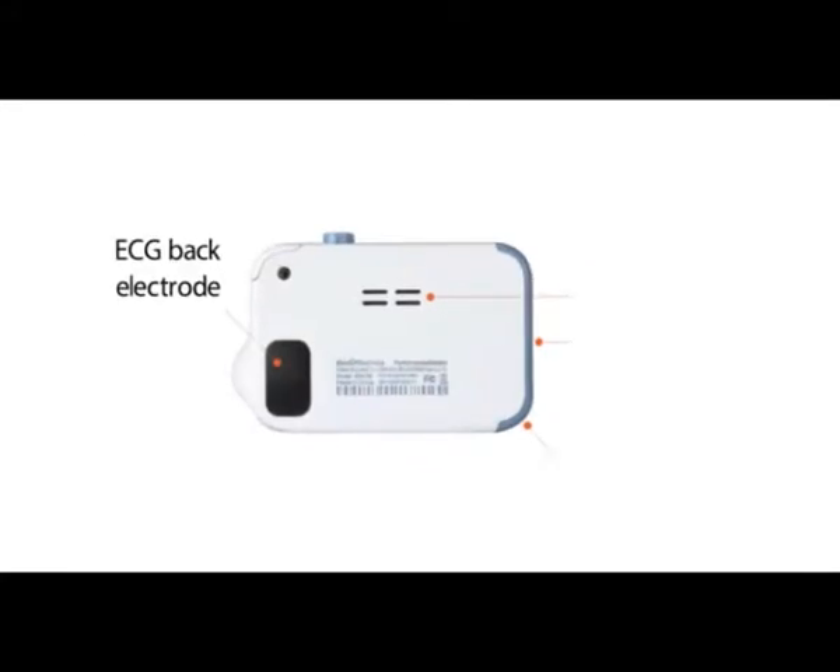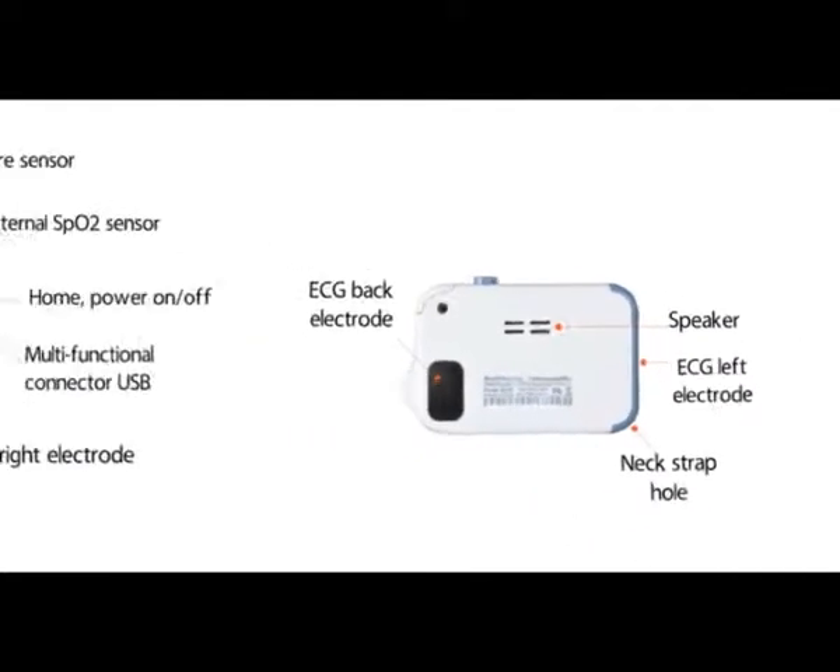On the back: the ECG back electrode, the speaker, the ECG left electrode, and the neck strap hole.